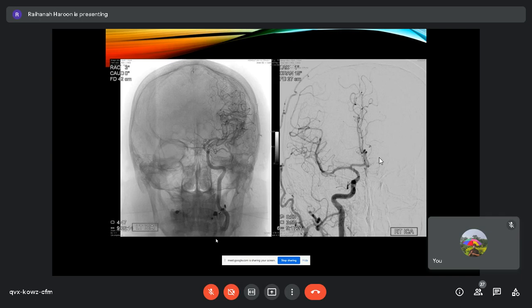For a cerebral angiogram, we start cannulating the right common carotid, the right brachiocephalic, the left vertebral, and the left subclavian. So this is an example of a frontal view, a native image. What I mean by a native image is that in this instance, Prof. Razali injects the contrast material. This lights up because it follows your blood flow, but it lights up just for a few seconds and then goes back to normal. And this is what we want to capture. This is why you need to take this image in a video-like form.